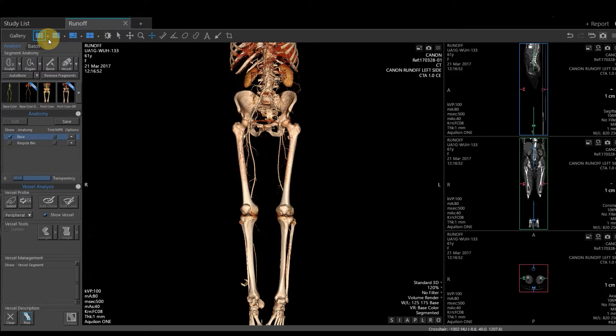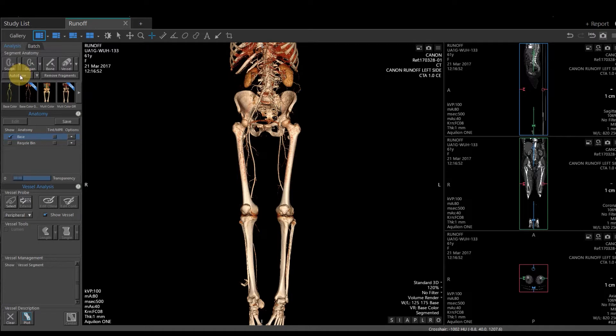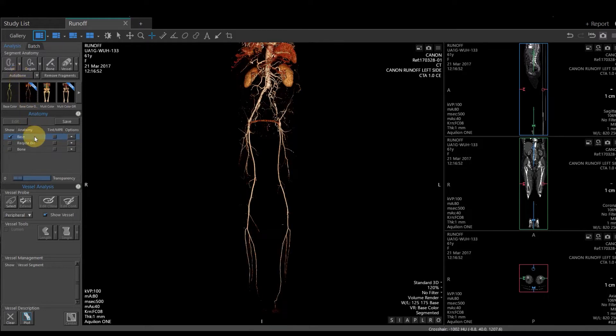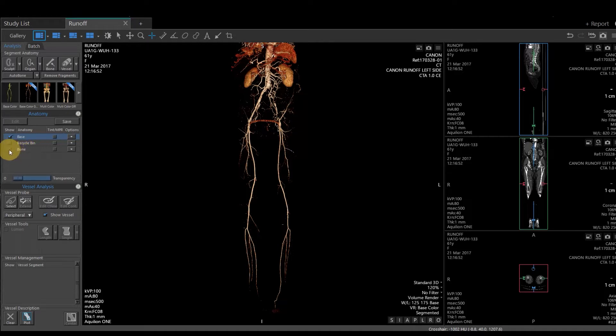The first thing I want to do is have the bone removed. You have an auto bone feature on the upper left-hand corner. So I want to select auto bone. Vitrea is going to go through and try to segment out all of the bone and create us a bone file that's directly under in the anatomy section. It doesn't get removed to the recycle bin. It just creates us an additional folder, and you can toggle this on and off by clicking the little check mark next to bone.